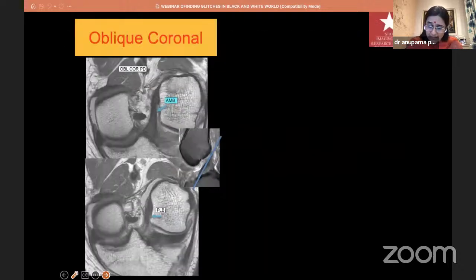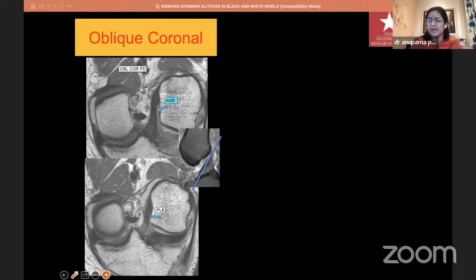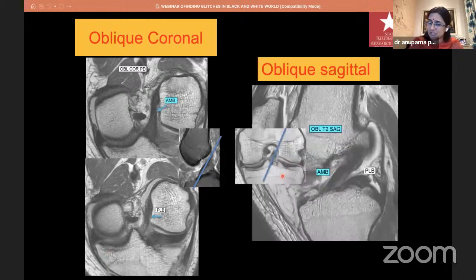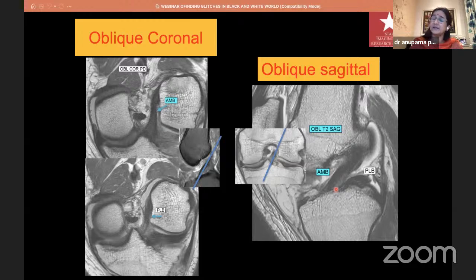At our center we routinely take oblique images through the ACL to eliminate any artifactual signals. I take an oblique coronal oblique to the plane of the ACL, which gives images that beautifully show both the anteromedial and posterolateral bundles. We also take oblique sagittal images — on a coronal image I go through the ACL sagittally and get an image where it is very easy to pick up an injury if it has occurred.